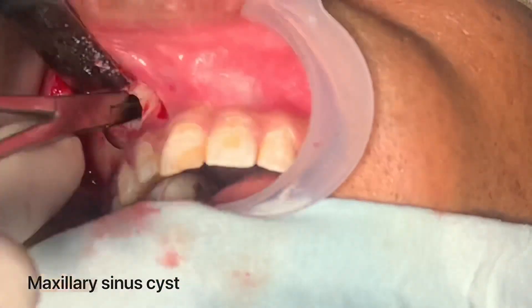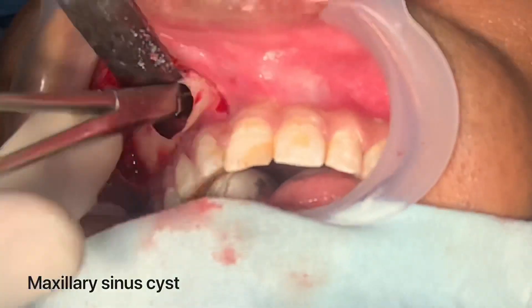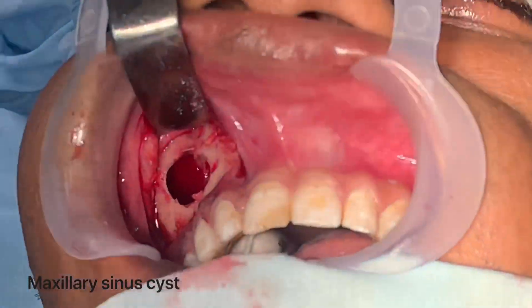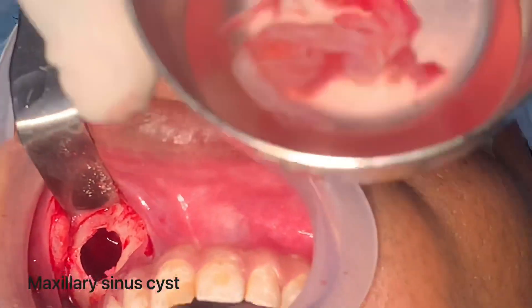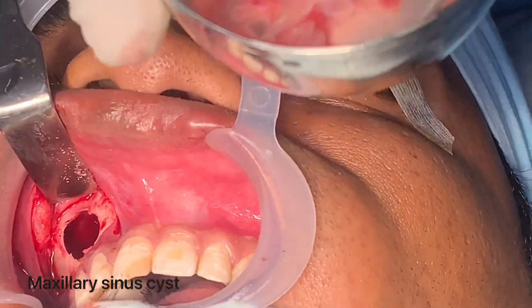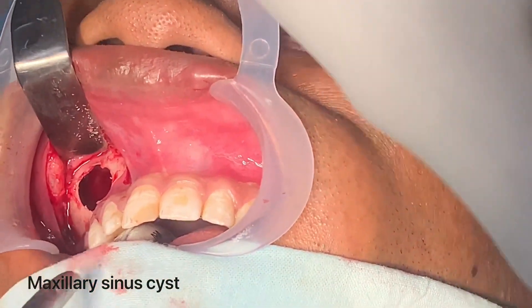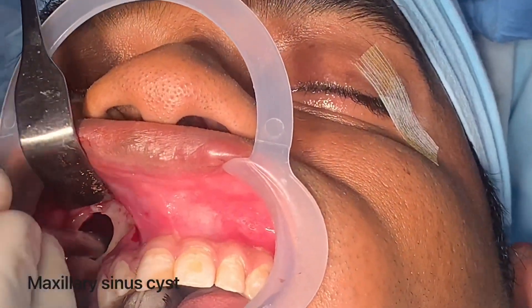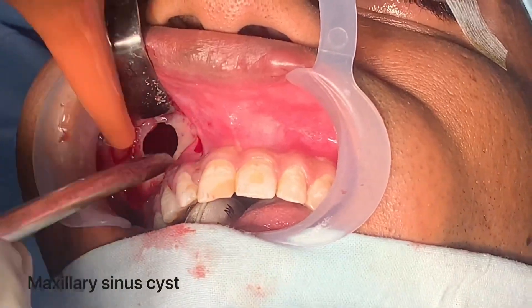I've removed it in total. Now I'm going to show you what we've removed. This is a Caldwell-Luc type of approach, and you can see the content here — just the lining. The cyst is filled with fluid, so all of that will have been sucked out.